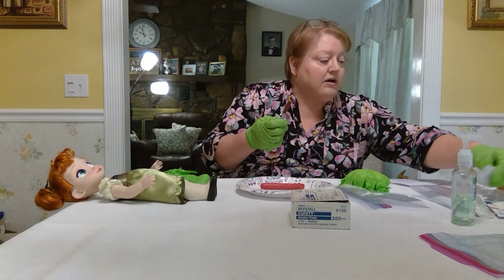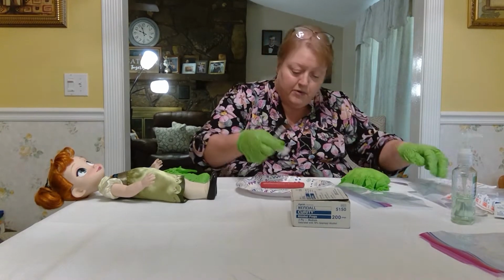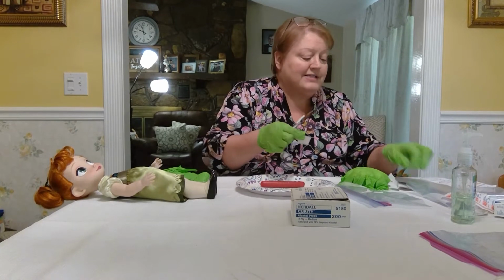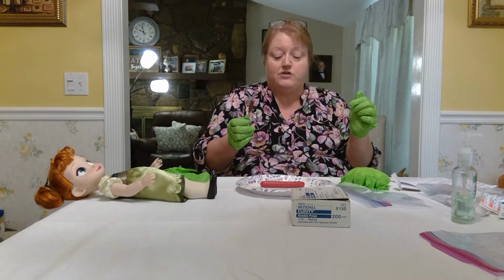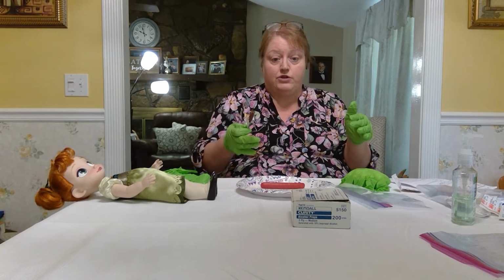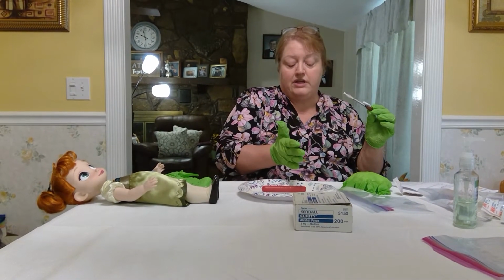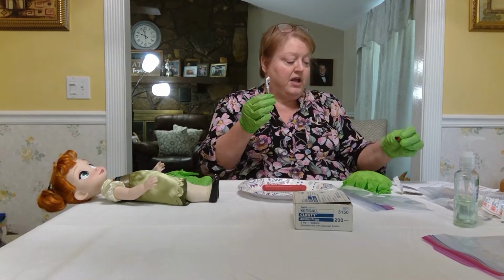I have my alcohol swabs ready. I'm going to clean the location. We're using a hot dog because that allows us to see a wheal. This is not easy to do. It took me multiple tries. You will need to make sure that you try this and practice it prior to doing this injection. And I found it easier to use the hot dog closer to the end. It tends to work better.